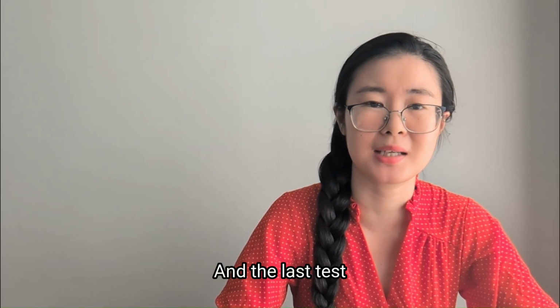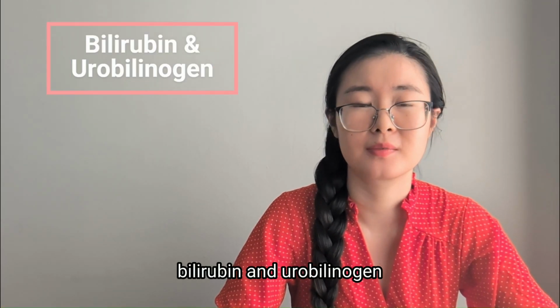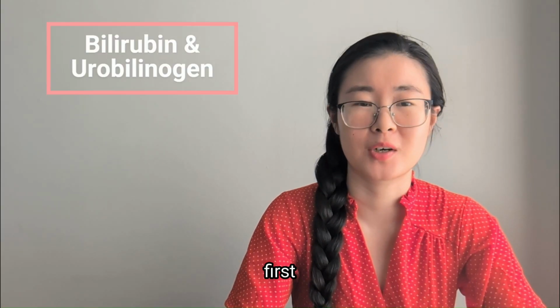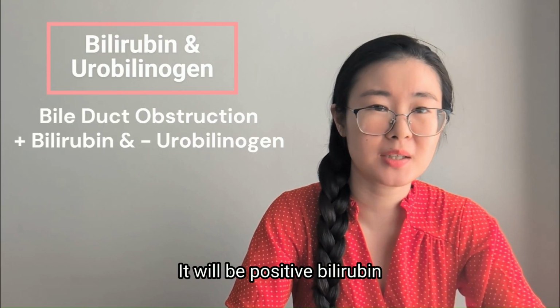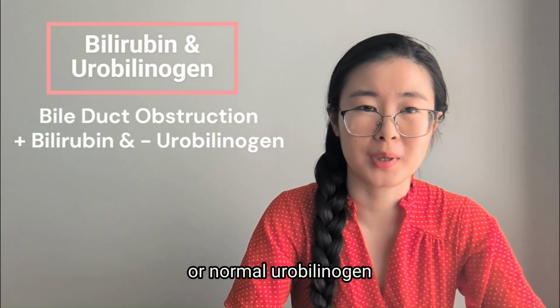And the last test is in a bundle, bilirubin and urobilinogen. There are 3 result combos you need to memorize. First, bile duct obstruction. It will be positive bilirubin, negative or normal urobilinogen.